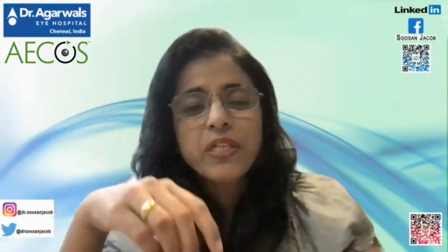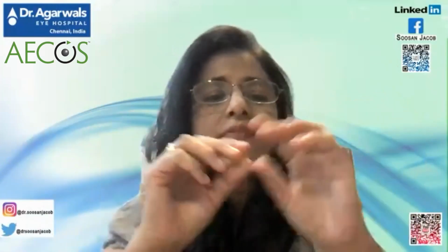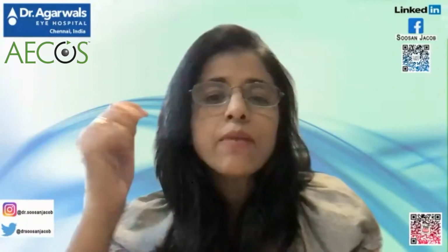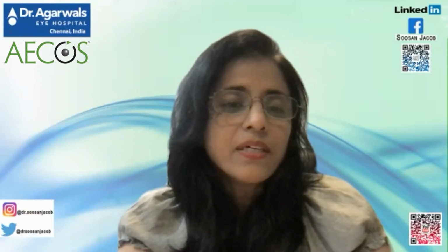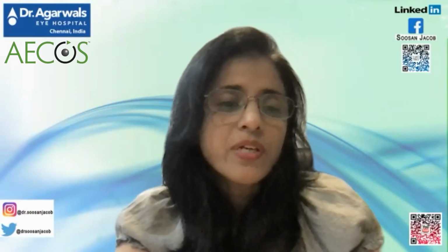So it's an emphysematous tissue, and that is not ideal for cutting rings, just because it's soft and spongy. You would cut with the trephine thinking you've got a certain amount of volume, but when all the air is absorbed once it's inside the patient's cornea, and it dehydrates, you would be left with a thin rim of tissue, not what you actually thought you got. So we wouldn't use that. But if you're doing DMEK, yes, you could, because in DMEK the stroma is completely virgin and you could just go ahead and use that.